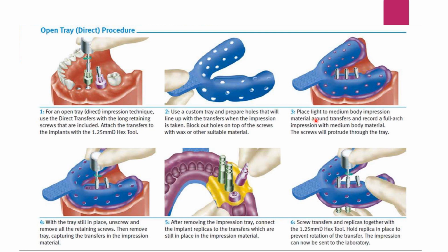Okay, so place light to medium body impression material around transfers and record a full arch impression with medium body. Okay, so medium body is being used.